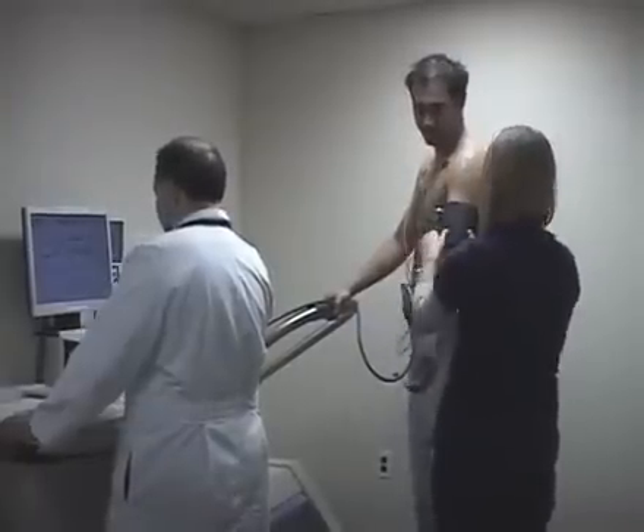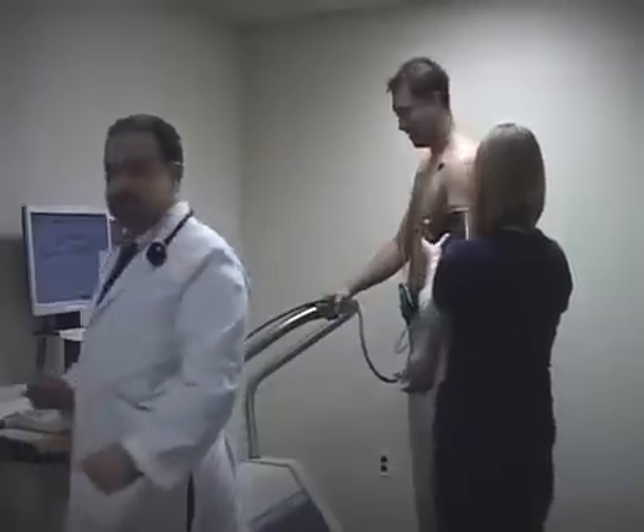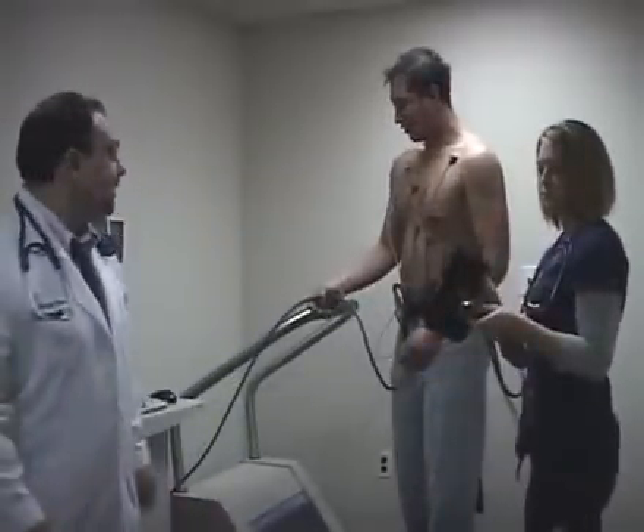Right now, we just got the last blood pressure reading of the patient and he finished the test without any difficulty.